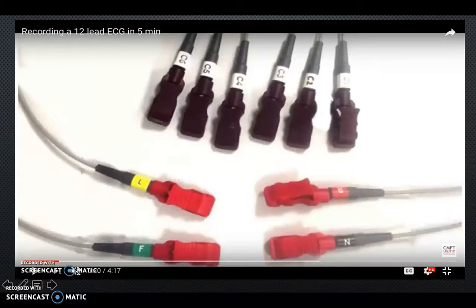Now that we've heard from Tim about some great tips and tricks on how to do an EKG, I'd like to go through how to physically do that EKG. A lot of the information here may be redundant, but we hope by giving you some redundant information that you're able to be successful in performing your EKG.